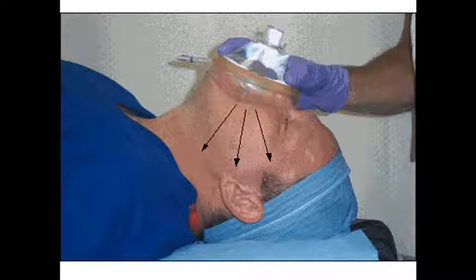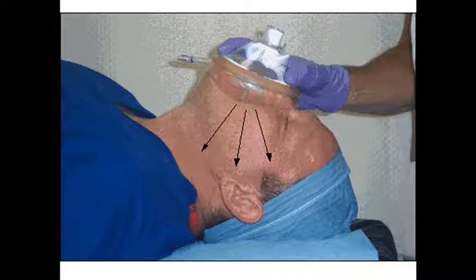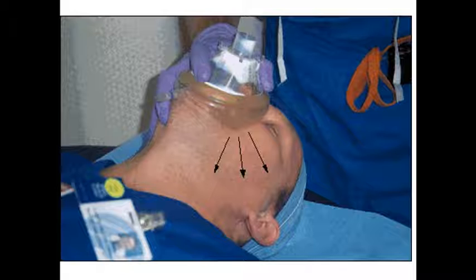If the green reservoir bag is becoming increasingly flaccid during the course of your manual ventilations, then it clearly means that you're losing volume from the breathing circuit. The simple explanation here is nearly always that you have a leak around the face mask, and that the pneumatic seal you are generating with your left hand is ineffective.